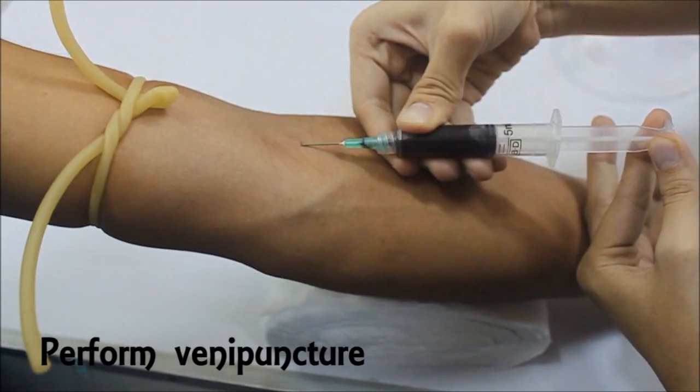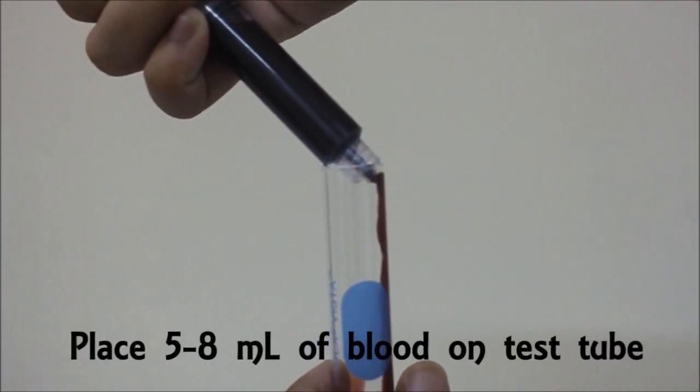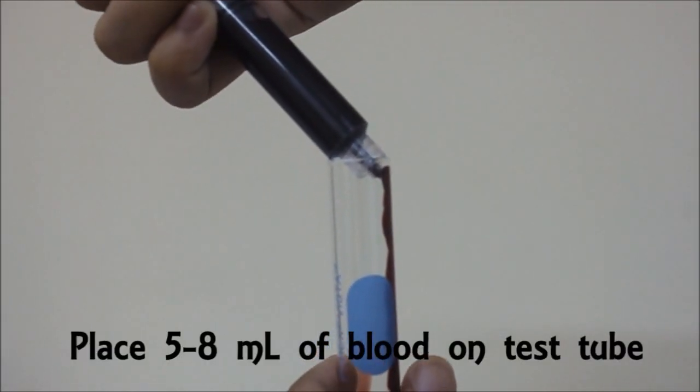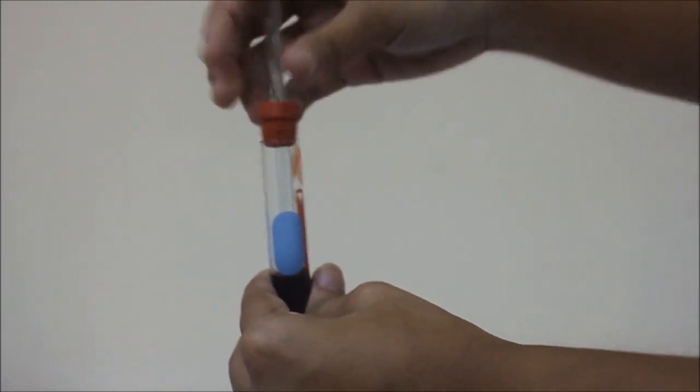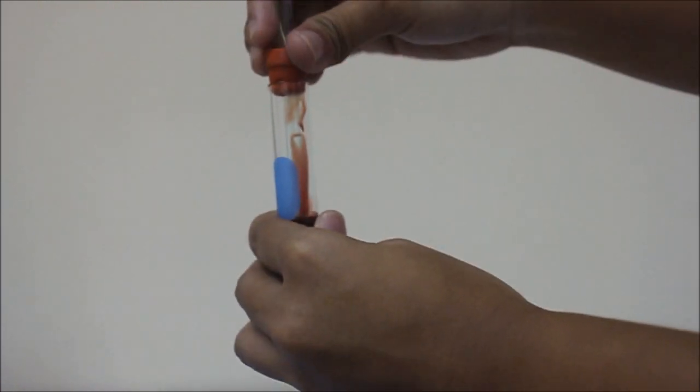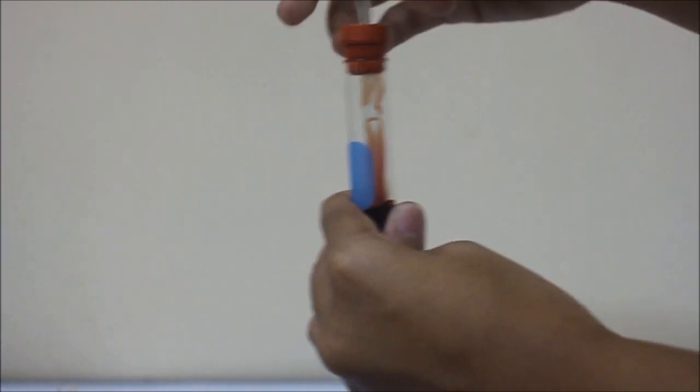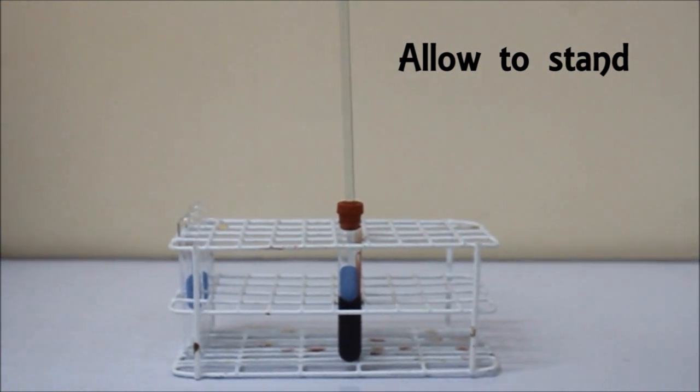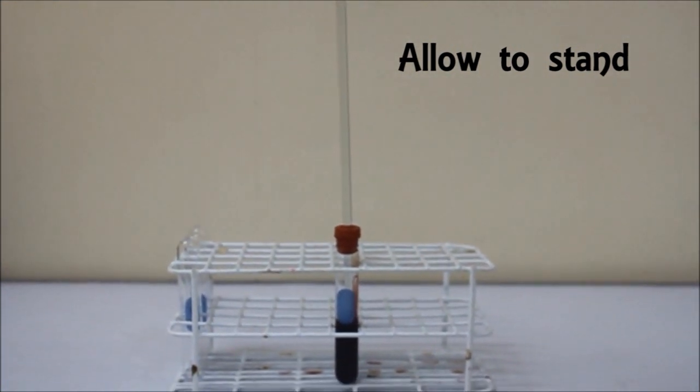To begin, collect blood by venipuncture. Place 5-8 mL of blood in a clean test tube. Cover the test tube with cork to which a stirring rod is fitted. Allow the setup to stand in a vertical position on a test tube rack.